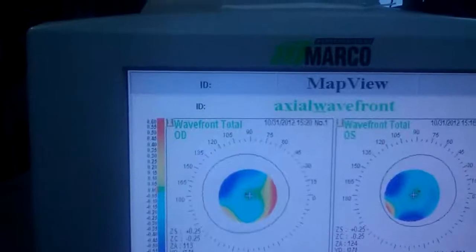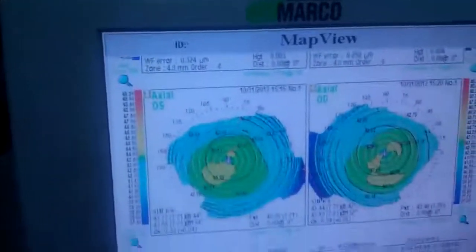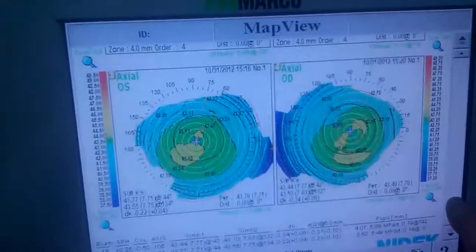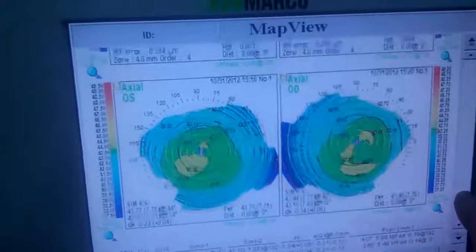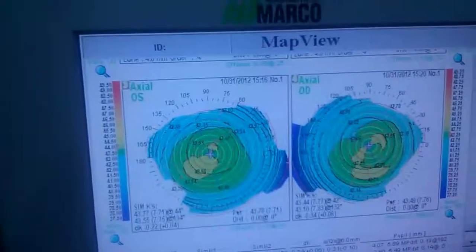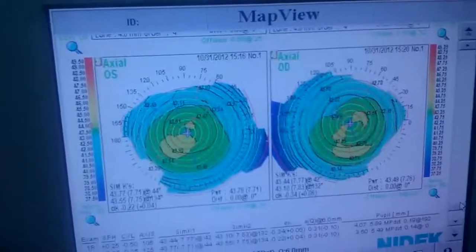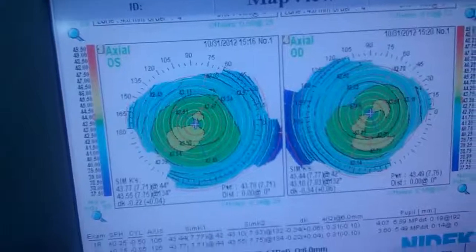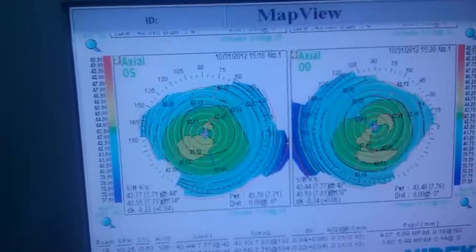And we scroll down here and we'll see the topographical layout — the map of each eye.